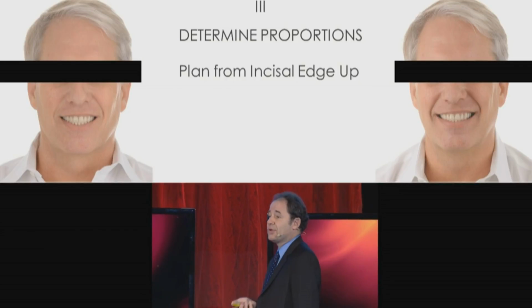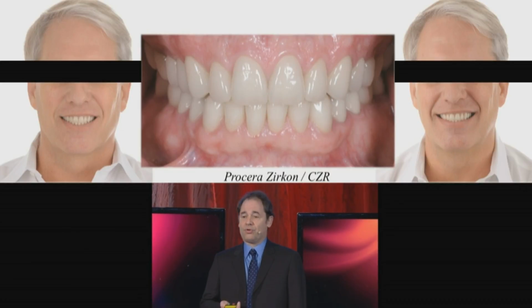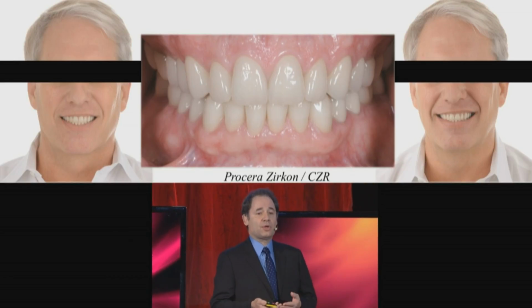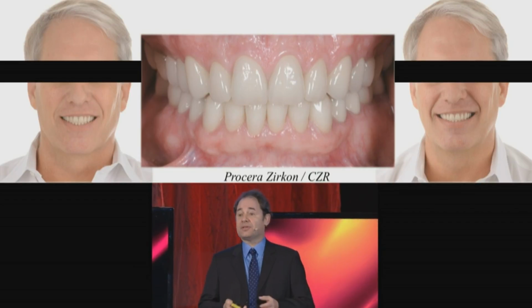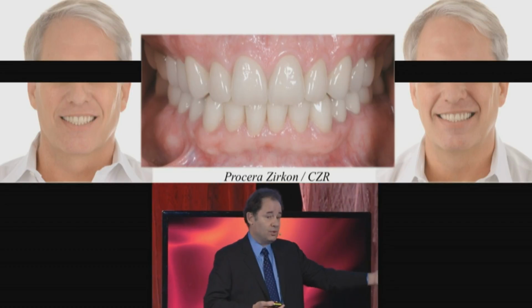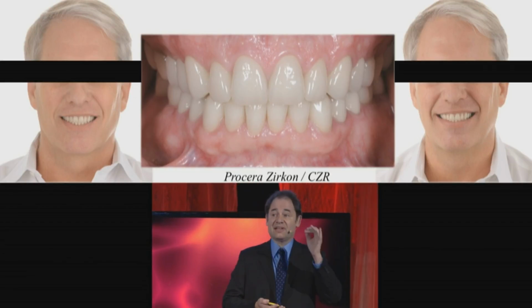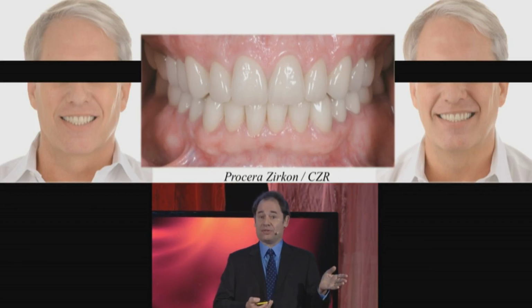First of all, let's look at the case a little bit closely. This is a total reconstruction. In the anterior zone, you have Procera zirconia. And the combination we use, we've been using that for 10 years, is by layering with a Noritake CZR. This combination was very well documented by Marcus Blatz, Stephen Chu, Gordon Christensen, and they showed that the performance is just about identical to PFM. So we're using this with great confidence.